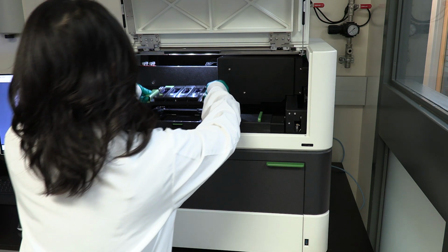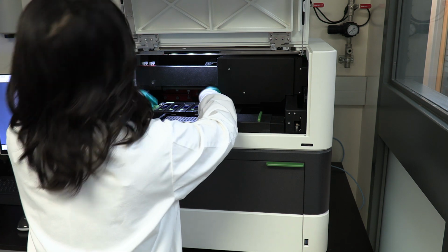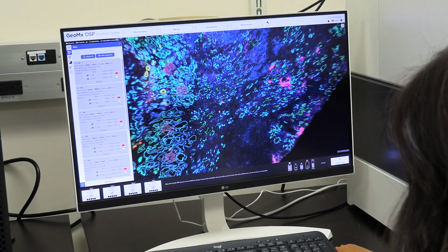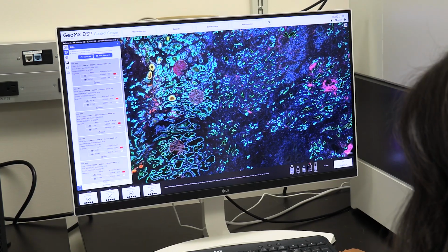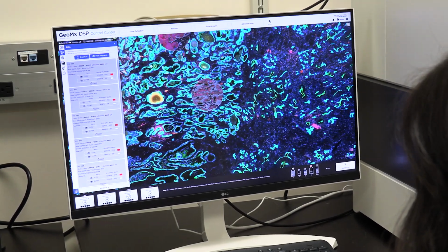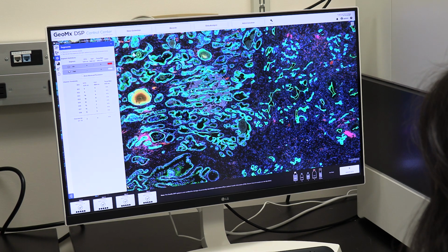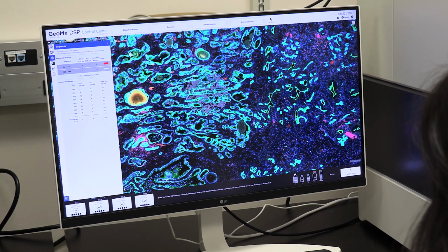Projects may focus on the location of the tumor cells as it relates to the surrounding normal cells that make up the cancer as a whole. One technology we have in diagnostic development allows us to use multiple fluorescence tags to look at different proteins or RNA molecules produced by the tumor cells and the surrounding normal cells. The location of tumor cells related to other cells in the cancer is important as we know that they influence each other. We can start to develop these cancer neighborhood maps and understand the extent of communication between cancerous and non-cancerous cells.